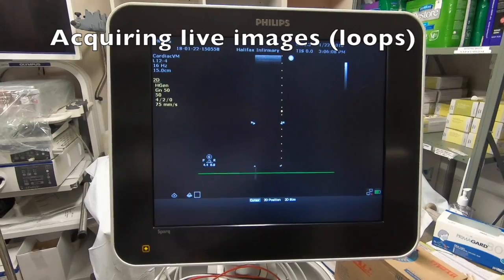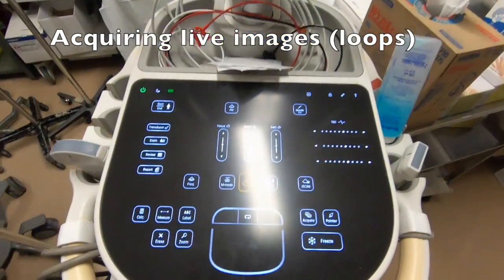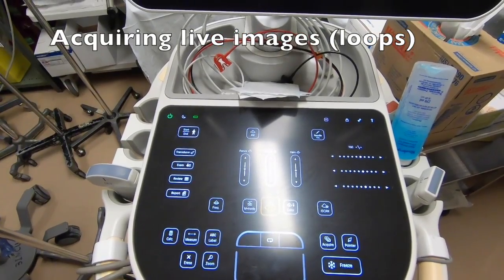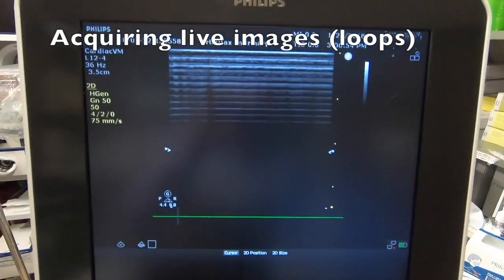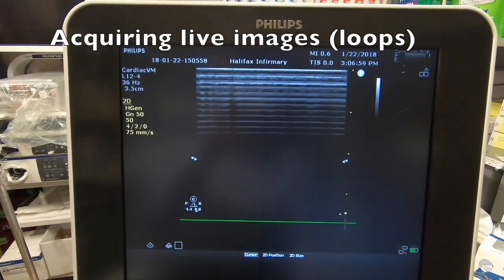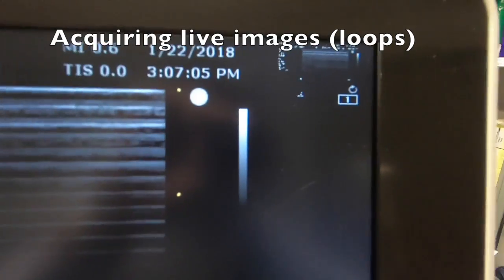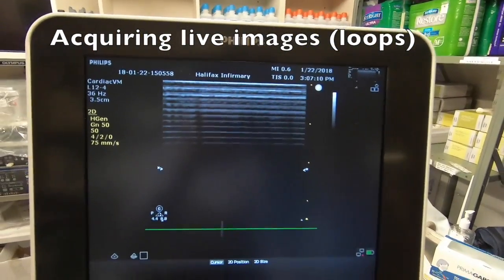There are two ways of acquiring live images. While you are positioning the probe, you may press the Acquire button, and it will begin recording a loop. When you hear the high-pitched tone, it means that it has finished recording the loop. You will see a new thumbnail on the right side, indicating that an image or loop has been acquired. You can tell if it's an image or a loop by looking for the loop icon. The circular arrow indicates that this is a video file.